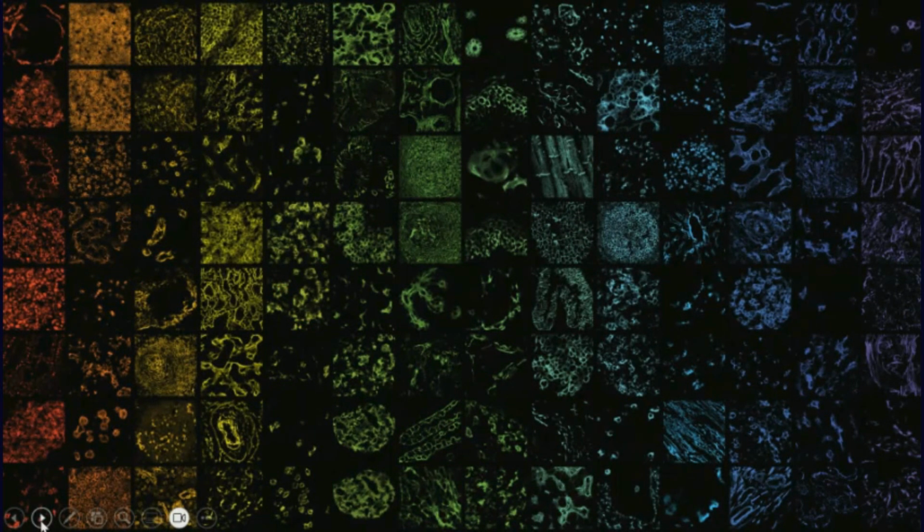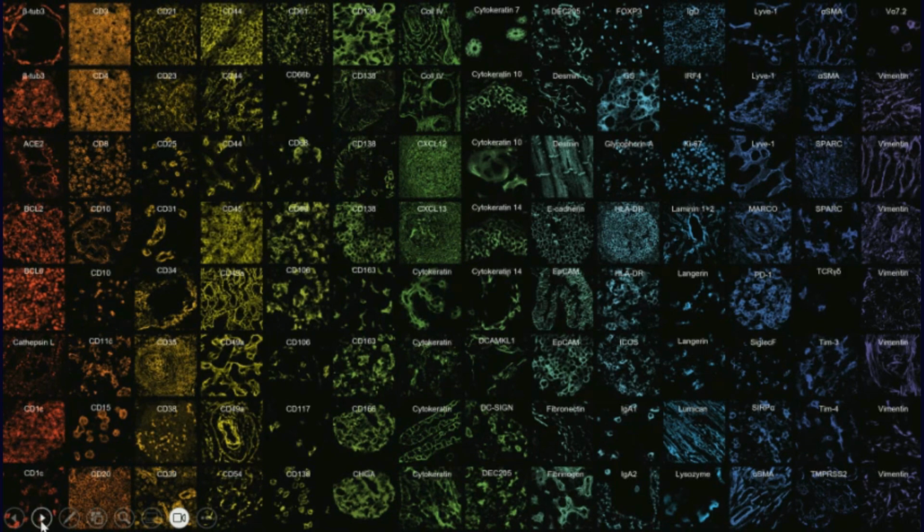My focus is very narrow when it comes to applications. It's focused on multiplexed immunofluorescence, and really highly multiplexed immunofluorescence. This just shows you a rainbow collage that I made of the images, of the different anatomical structures and cell types. And this is always the why behind the how, that we would map these tissues, both normal and diseased. In order to do so, we did this with antibodies.